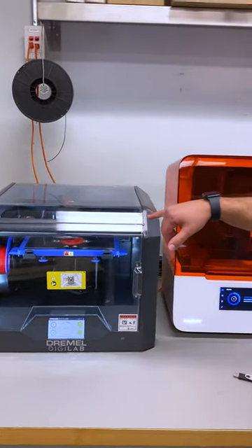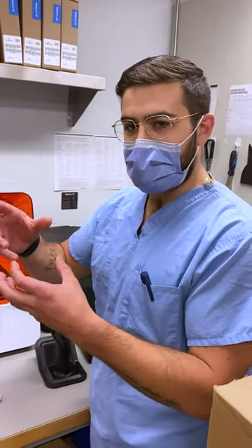Currently being built here is a socket that's going to be used on a Philips FMS rack to hand tighten.